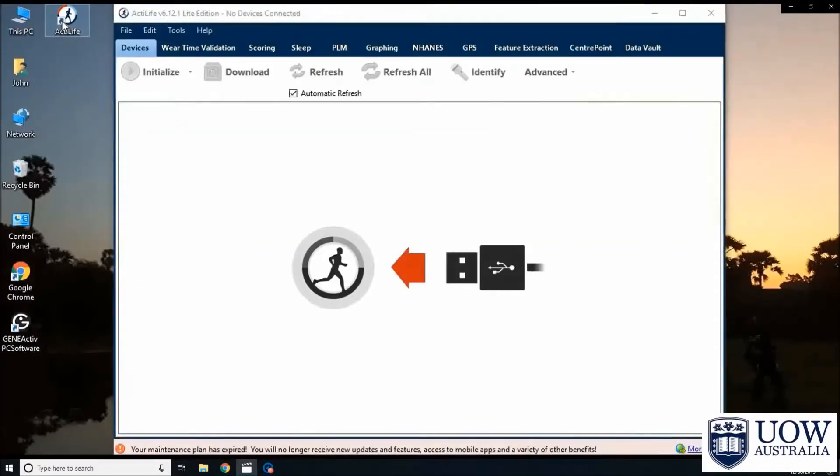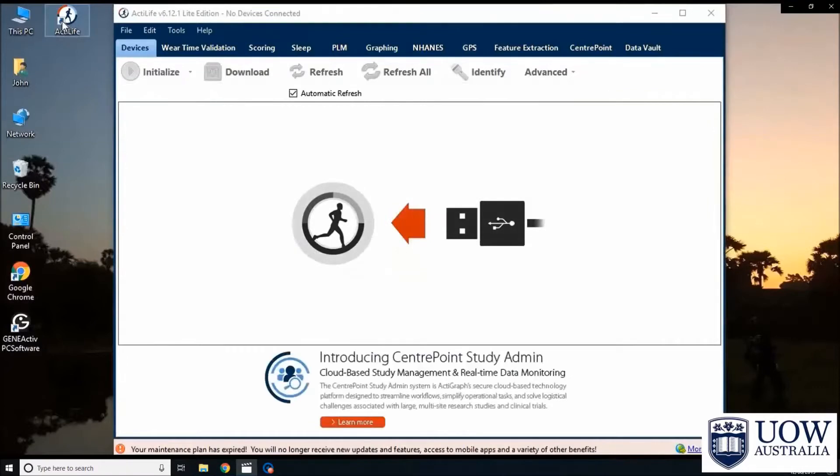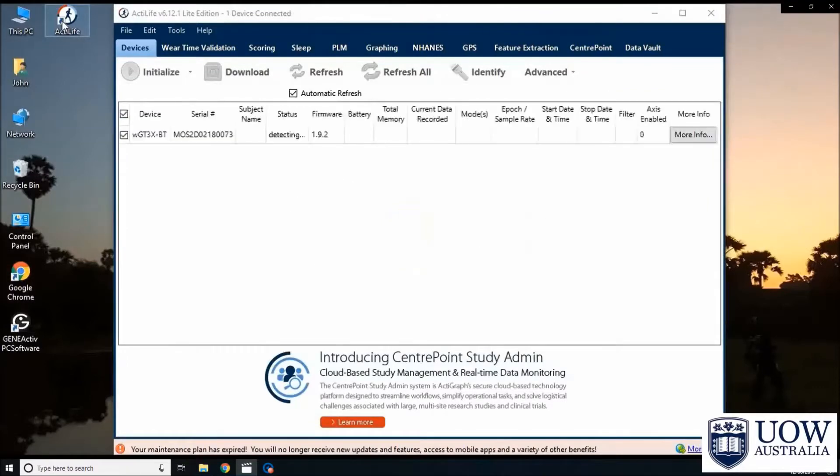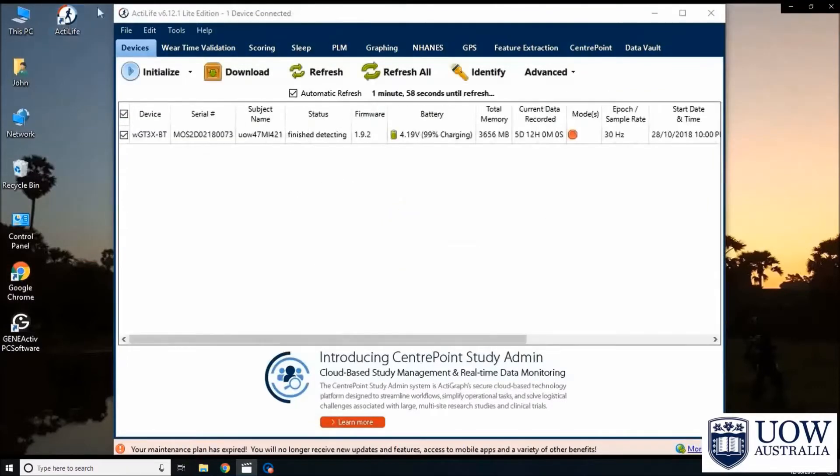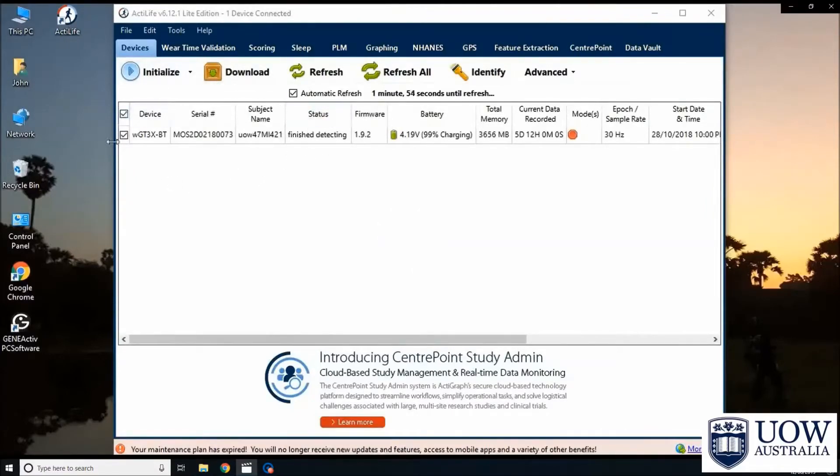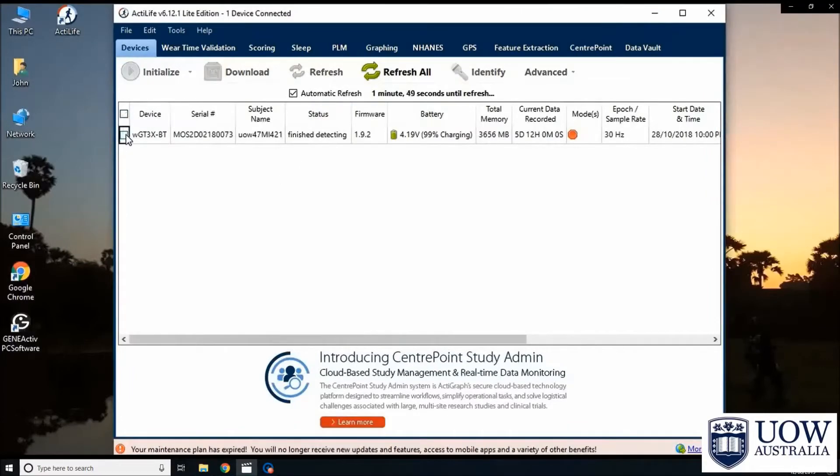Connect the accelerometer to the computer using the USB cable and wait for the accelerometer information to show up in the software. Select the accelerometer that will be downloaded by checking the box next to the device column.